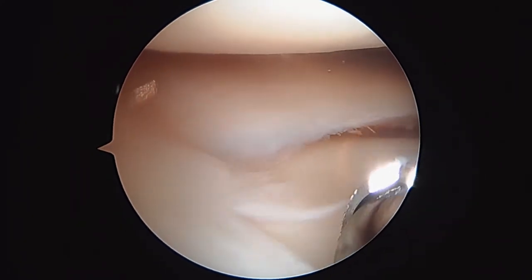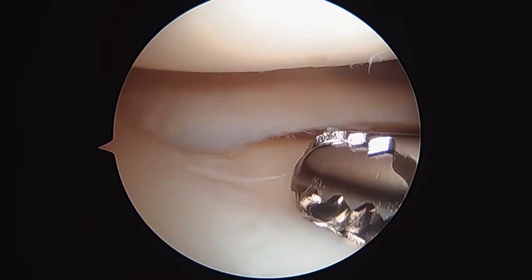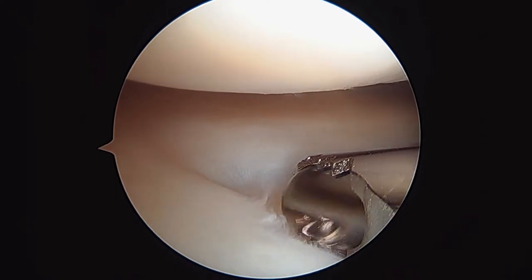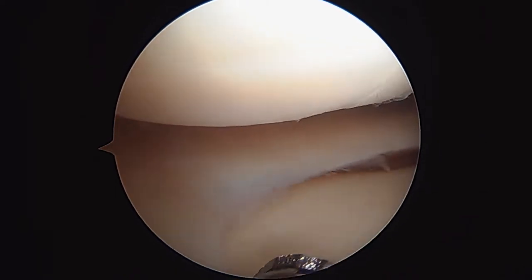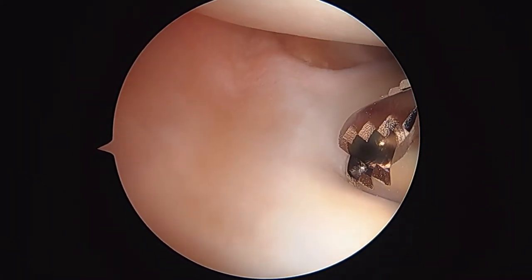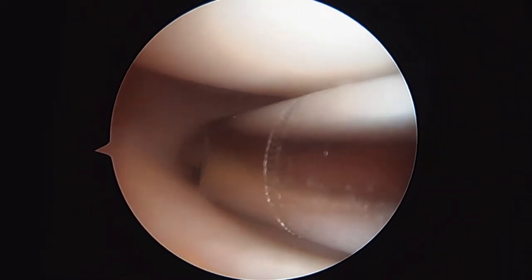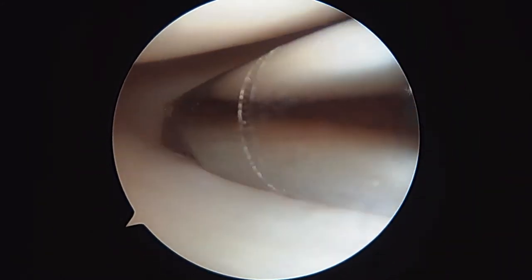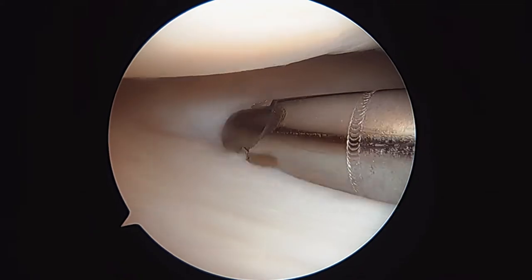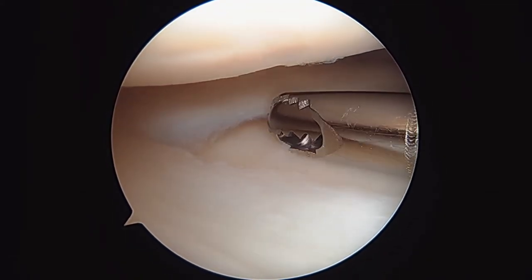There's a little bit of a meniscal flap tear — see that right there? But again, that's magnified 30 or 40 times on the screen. That's not a repairable thing, that's a trimmable thing. So that tear is now no more. As we look at the meniscal capsular junction, that looks pretty good too as we come around more anteriorly. I'm actually very optimistic that we ought to be able to get you back to doing all the things you want to do without a major meniscal repair here.